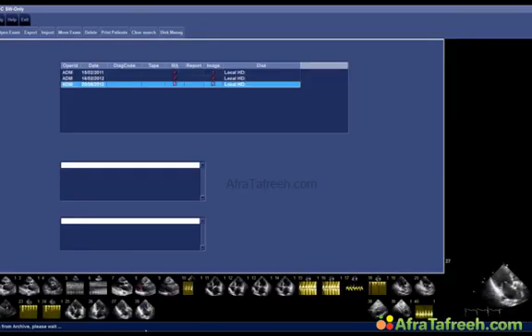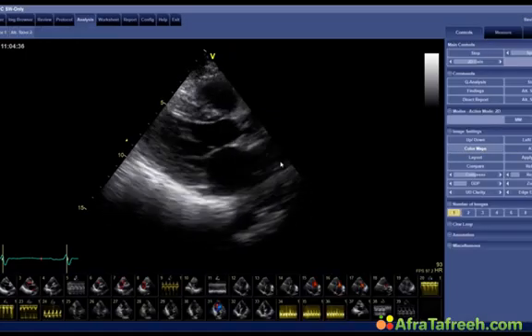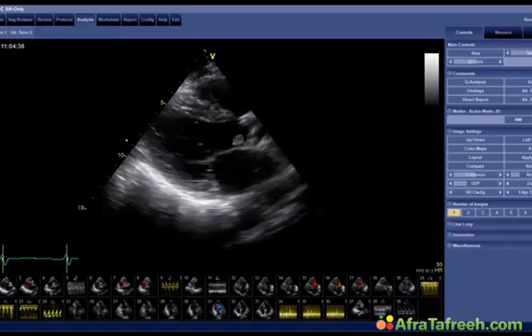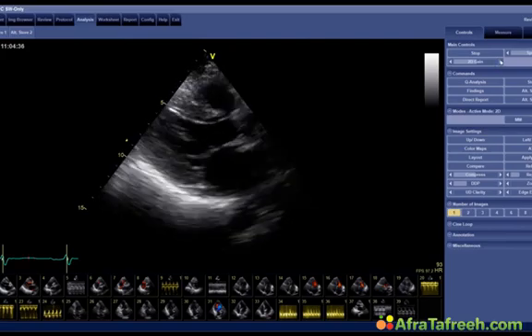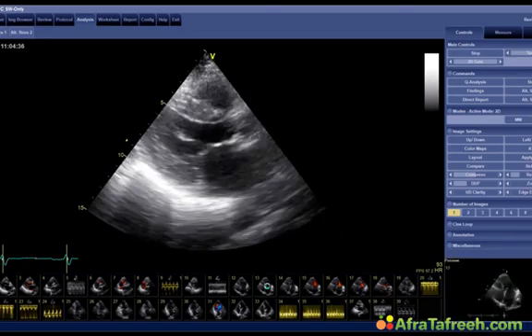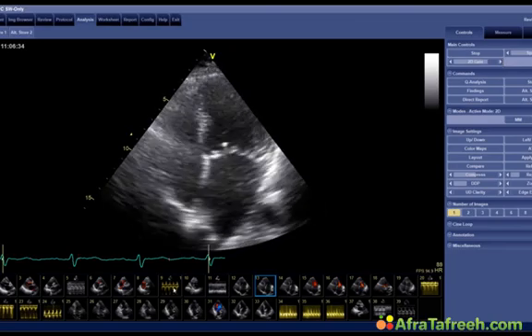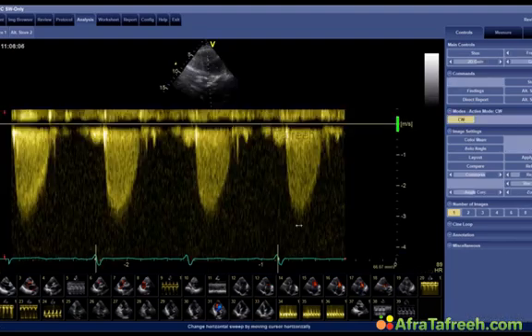But I will show you the first study that I have from her, which was performed in February of 2011, so 1.5 years ago. And to make things short, she has aortic stenosis. Remember, we said that most of our cases today will be dealing with the aortic valve. Now, see good left ventricular function. I'll just increase the gain here. We have aortic valve sclerosis, or thickening of the aortic valve, and calcification, rather. And here's the gradient. This was the gradient 1.5 years ago.